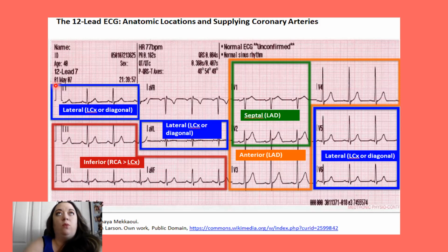It's a good question, because when your patient's in the hospital, they're already sick. They're not above also having a heart attack in the middle of their hospital visit. That happens too. So even being on the floor in ICU, med surg, or tele, if they're admitted anywhere, those nurses should still know, hey, my patient started having chest pain or epigastric pain, or shortness of breath over like 60 years old, there's those reasons I would do an EKG. If your patient meets any of that criteria, those nurses should at least know, hey, I need to do the 12 lead to rule this out.